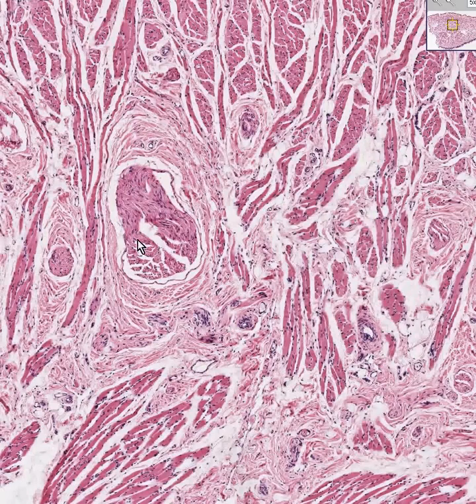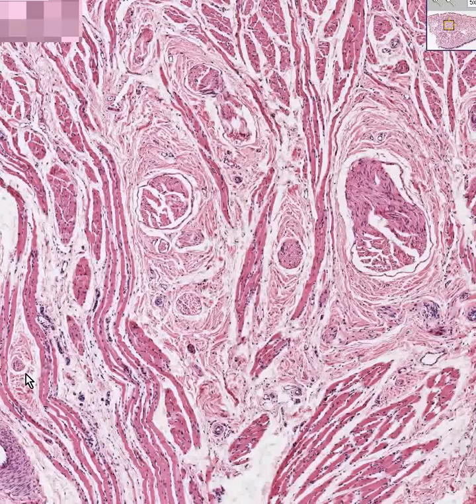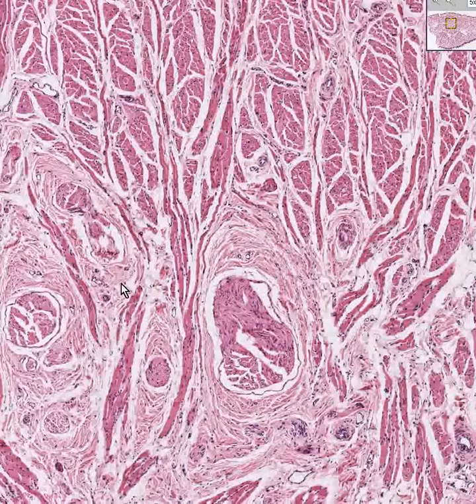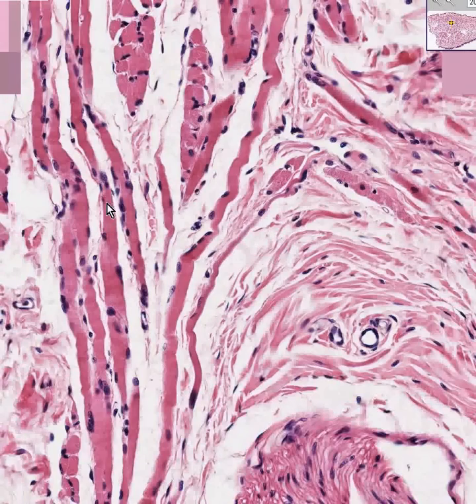There's a nerve, there's a nerve, there's a small artery or arteriole, that looks like a nerve, there's a huge artery cut transversely, probably the same thing here cut a little bit obliquely, and skeletal muscle fibers running every which way. You know they're skeletal muscle because when you look at them, the nuclei are all at the periphery of the fiber and they have little striations as well.